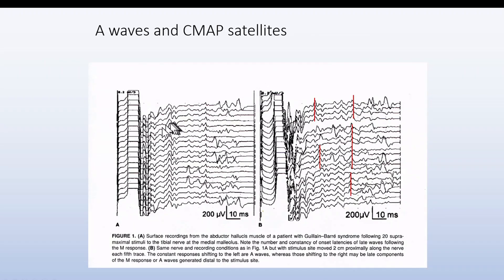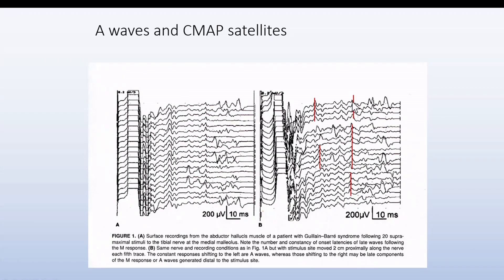Here is such an example with a complex recording from the tibial nerve. We have moved the stimulating electrode approximately a few centimeters in steps. The latency increases for the CMAP, and here you have a component whose latency also increases slightly — so this must be a CMAP satellite. But another component becomes shorter and shorter — so this is an A wave. During the same recording we have both A waves and CMAP satellites.